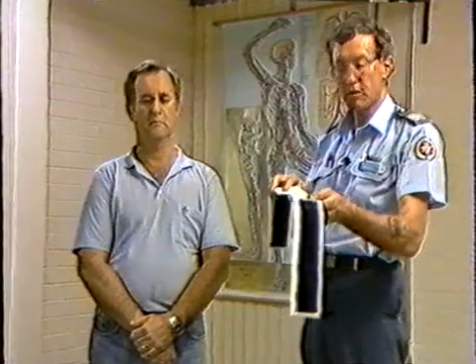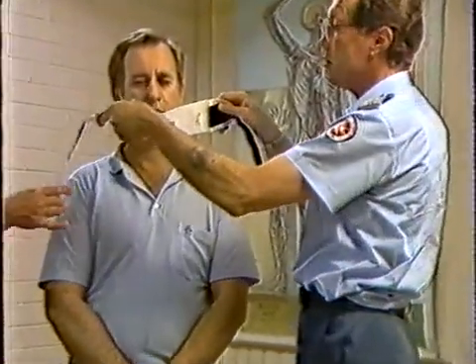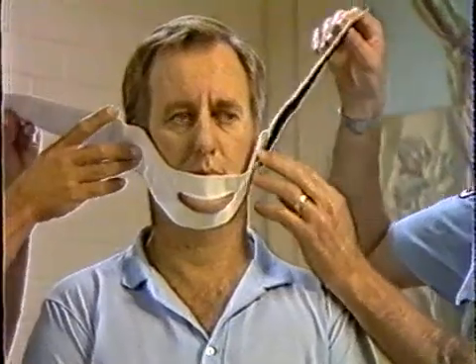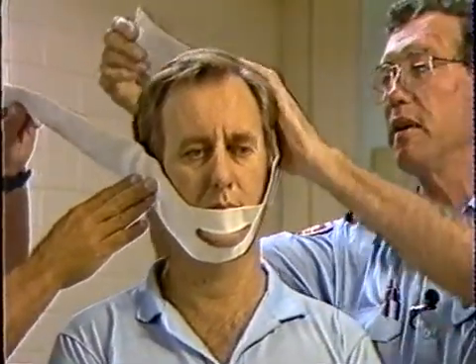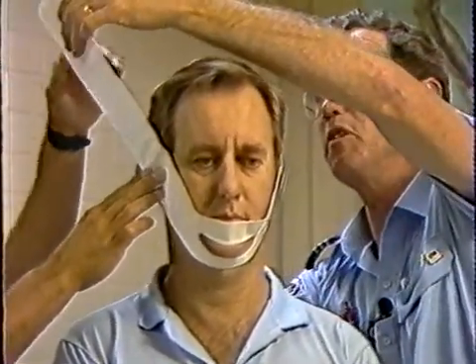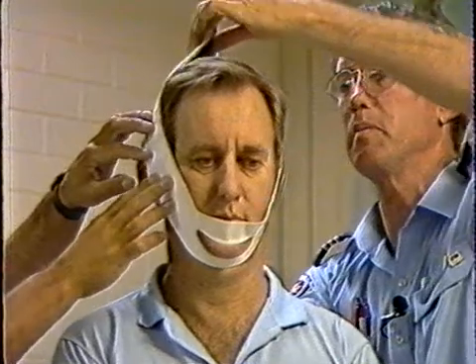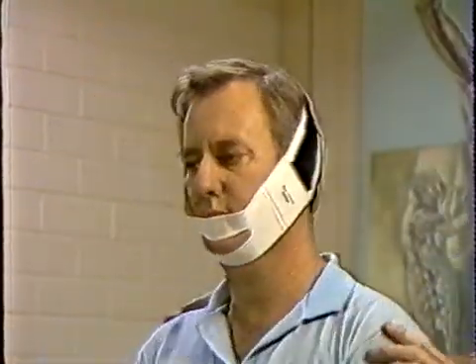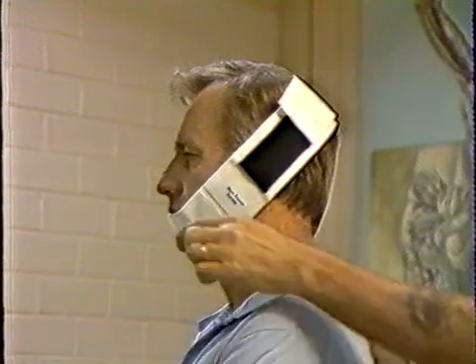So with this, the window over the chin, make sure it's in the centre. You take the strap up the line of the mandible, over the ear, over the crown of the head, and then with this one you just apply that last little bit of pressure for the lift and apply the Velcro. And if you turn to the side end, we now see we have complete support along the whole line, and there is no stress at all on the mandible.